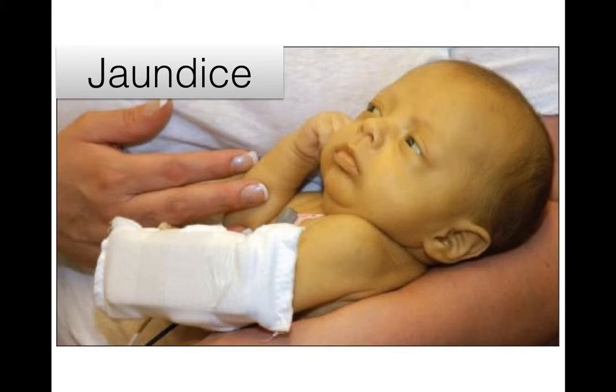When you see this kind of presentation, maybe it is a hepatobiliary problem, but if it is caused by some obstruction, ultrasound can help to identify that kind of obstruction. So this is the first indication when you are trying to apply ultrasound to scan for the hepatobiliary condition.